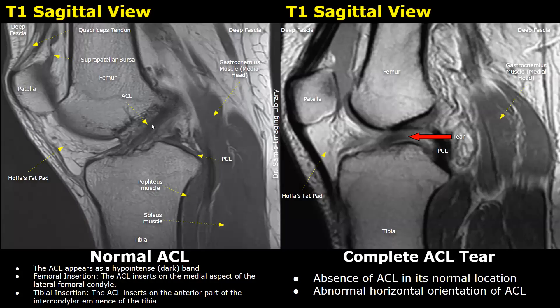We will compare the normal MRI image of the ACL with ACL tears. These are T1-weighted images in sagittal plane. This is the knee — this bone is the femur, and the bone over here is the tibia. This bone is the patella. We can also see the Hoffa's fat pad appearing hyperintense in T1 images.